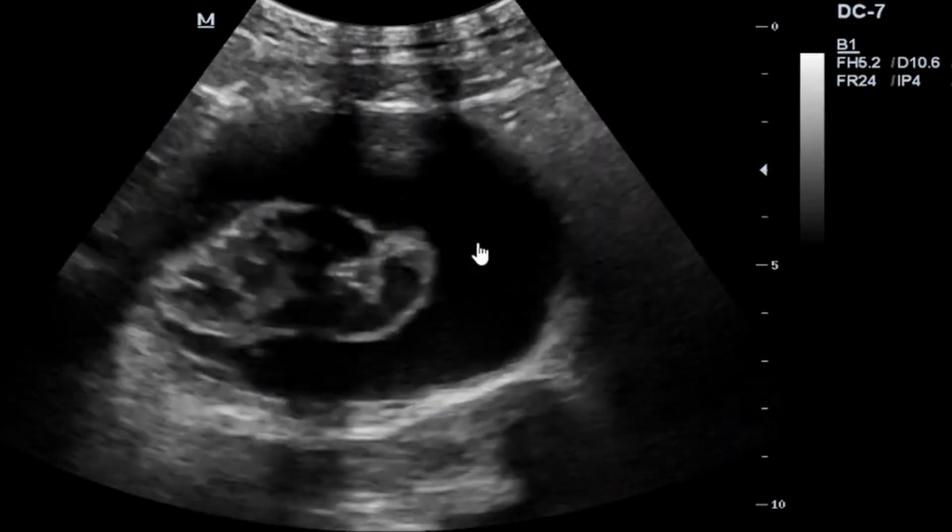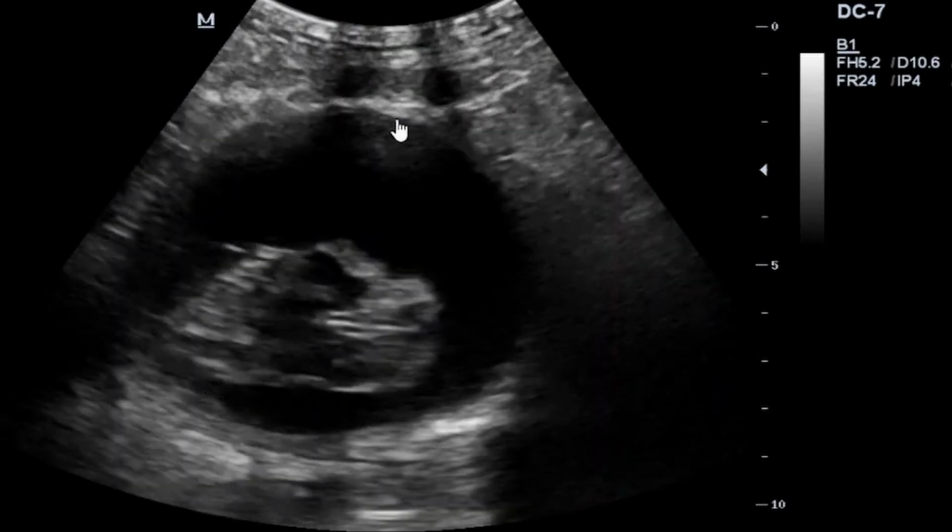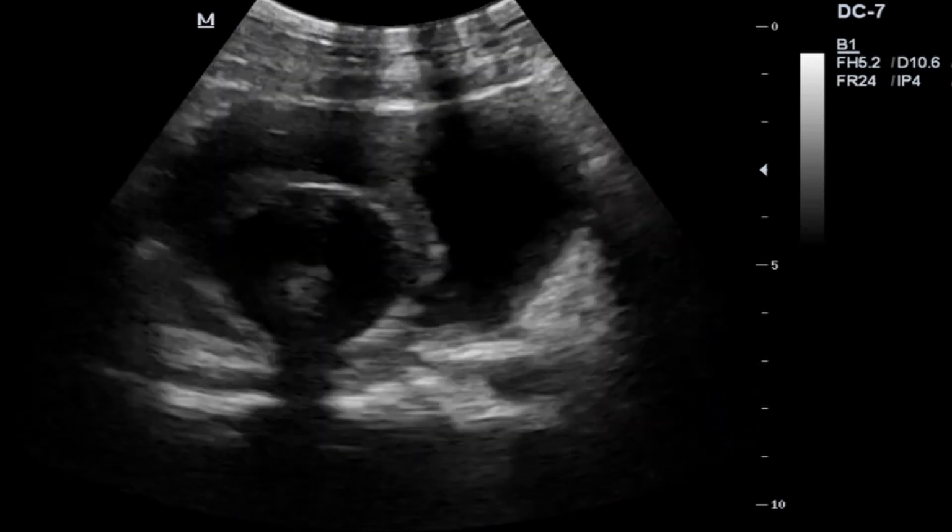The same lesion, this is our urinary bladder. You can see the urinary bladder filled with urine, and you can see the lesion that we have here. It is irregular in outline, and you can see this area is hypoechoic and this area is hyperechoic, so it has mixed echogenicity. This is in keeping with an organizing hematoma.